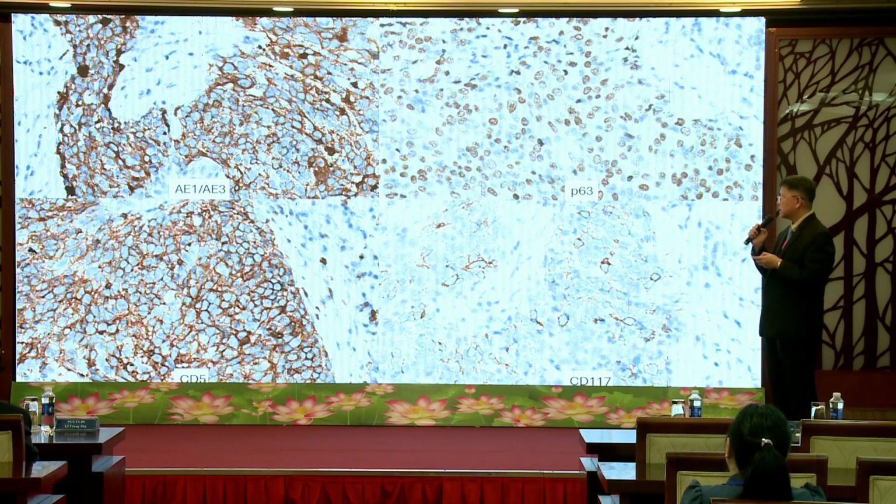Okay, so actually I think the first impression you must think of is intrathyroid thymic carcinoma, and then if it's not, you can rule out metastatic undifferentiated carcinoma later. But the first diagnosis you should think of is intrathyroid thymic carcinoma if you see this morphology.